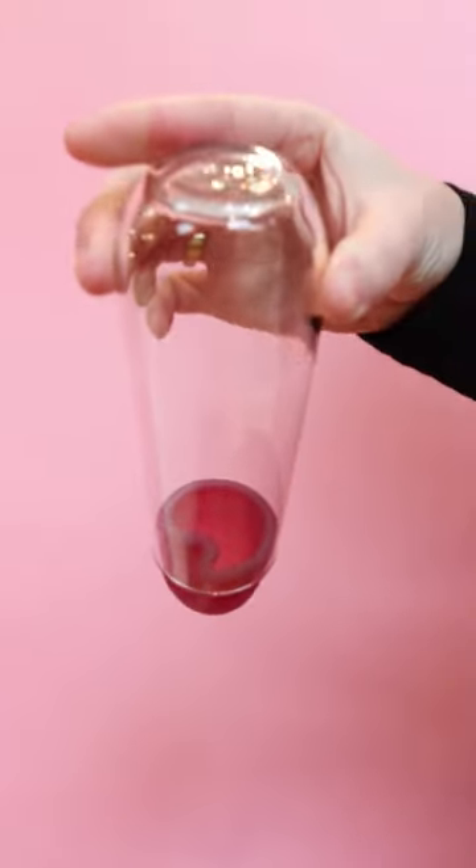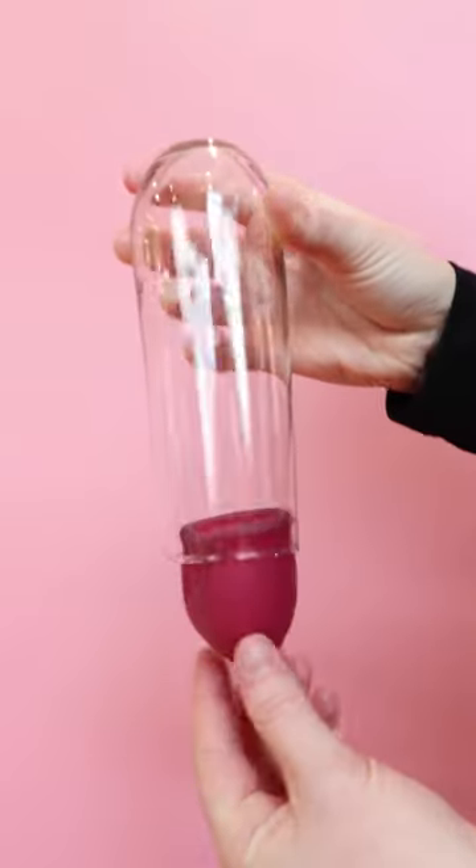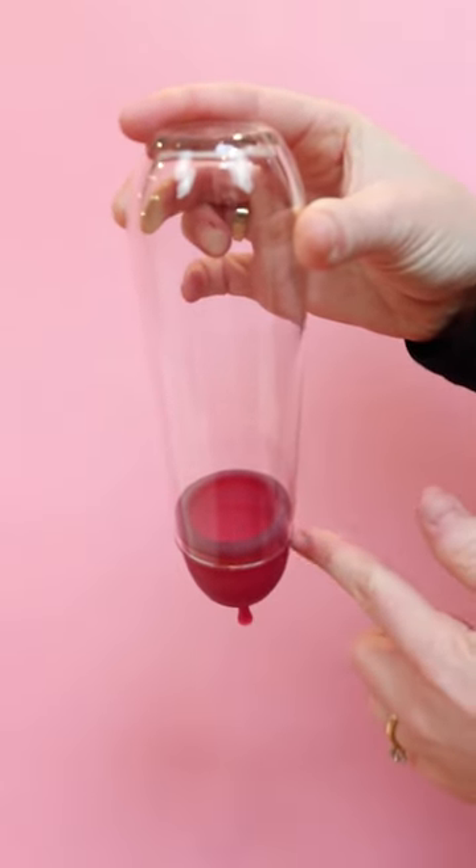This is the tricky part. Sometimes when you go to insert your cup it doesn't fully open. It still has that little fold — and that's going to cause leaks. So what you want to do is twist it, turn it, and kind of maneuver it until it does fully open.